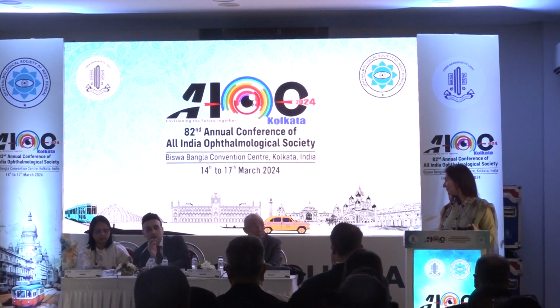Audrey, let me ask a quick question then. What are your thoughts on, to avoid bleeding from the PI, a lot of people say, especially in the Fuchs cases, maybe doing the PI preoperatively with the laser so you avoid the issues when you're doing it intraoperatively. And the second thing I was going to ask was, there's some discussion about maybe trying to give some fibrinolytic to get rid of fibrin, because even though you get rid of blood, of course you're going to get more aqueous fibrin release as well, which obviously is very difficult to get rid of. And with an endo-out technique, you've always got the chance of it sticking like glue to the fibrin area. Do you know what I mean?